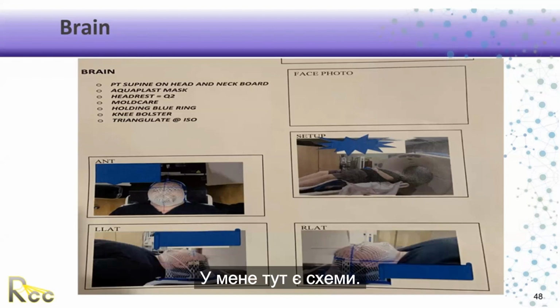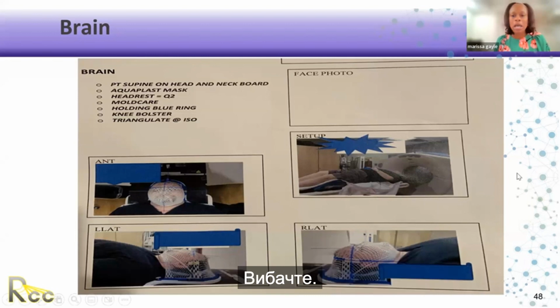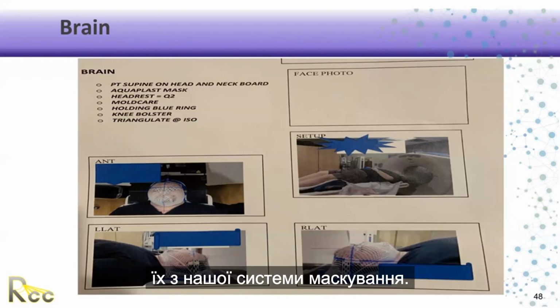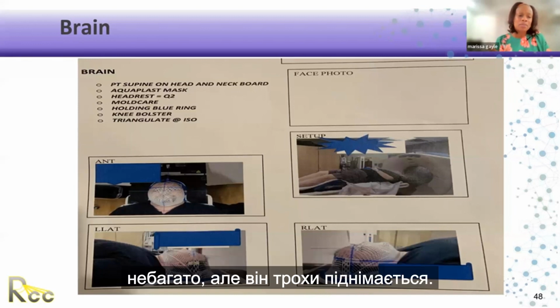I have some diagrams in here. I didn't realize I talked too much. I'm sorry. That shows some of our setups, and you can see it from our masking system. This one clips in, but there is a little bit of wiggle room within the masking, not a lot, but they set up amazingly well.